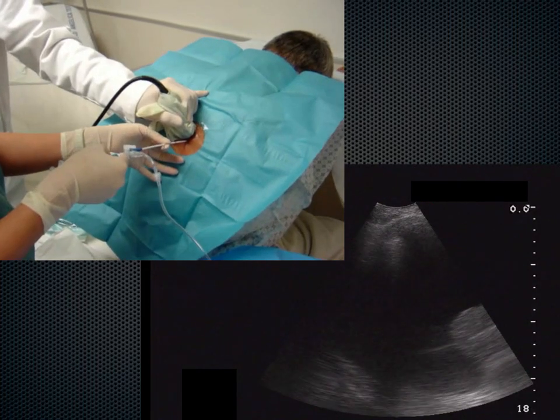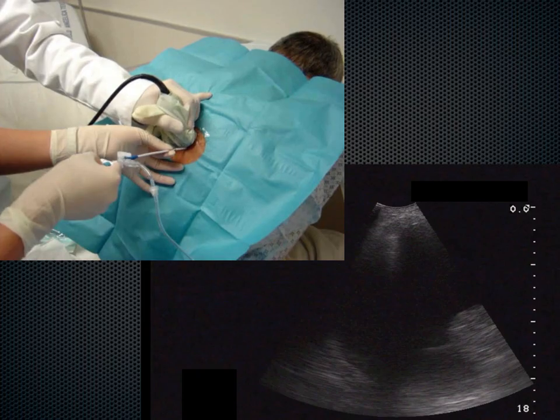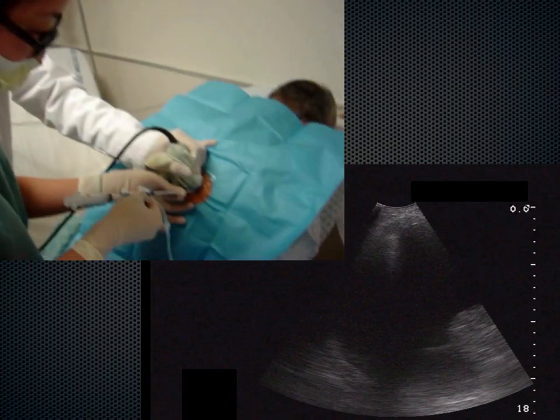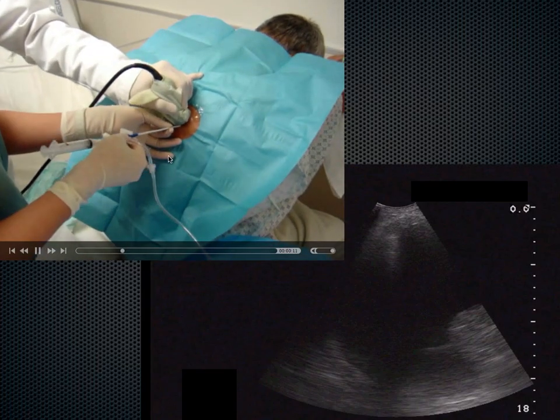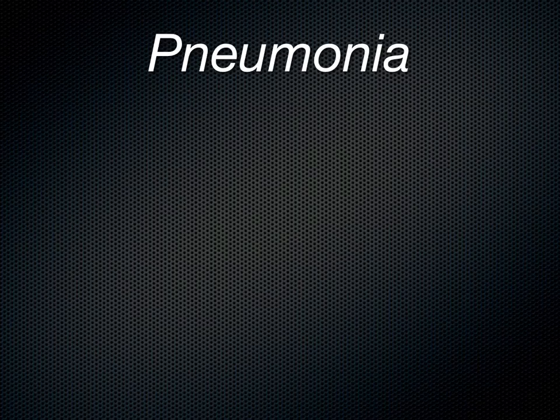Okay. See my needle. So sometimes it takes two operators depending on your kit. Just incorporate someone else in your field. This person should have a mask on. Like here is an example of how you can basically watch in real time what's going on.